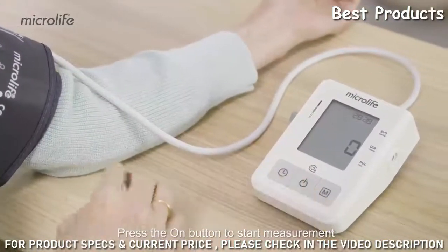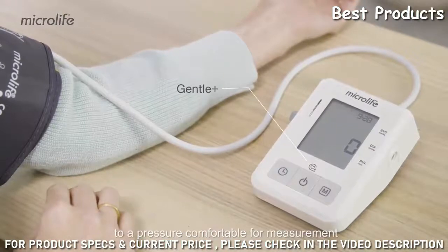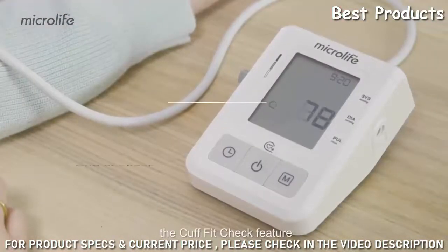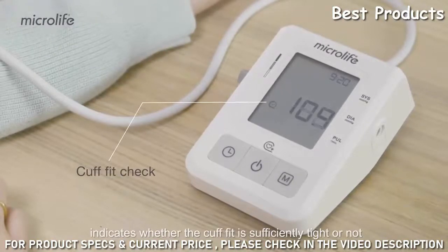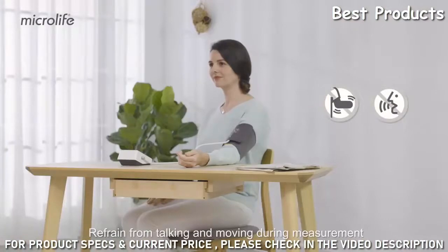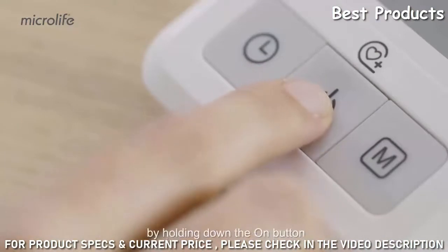Press the On button to start measurement. The Gentle Plus feature inflates the cuff to a pressure comfortable for measurement. During inflation, the Cuff Fit Check feature indicates whether the cuff fit is sufficiently tight or not. Refrain from talking and moving during measurement. You can also manually inflate the cuff to a pressure of your choice by holding down the On button.